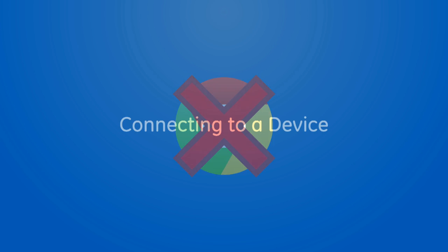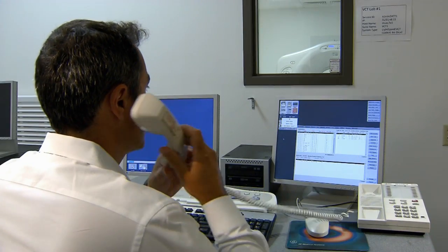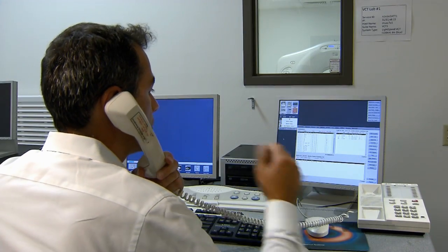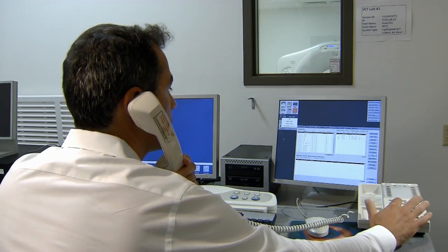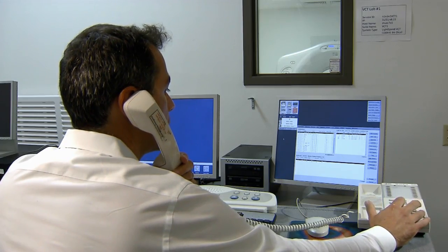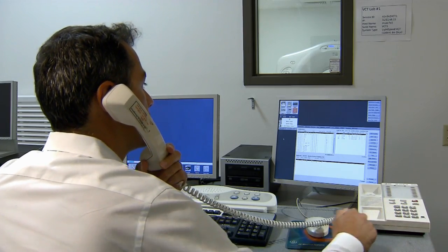Let's connect to a device. With Remote Console, you must have a technologist present at the device to permit the connection. Once the technologist and remote user are connected by phone, the remote user can begin the connection process.